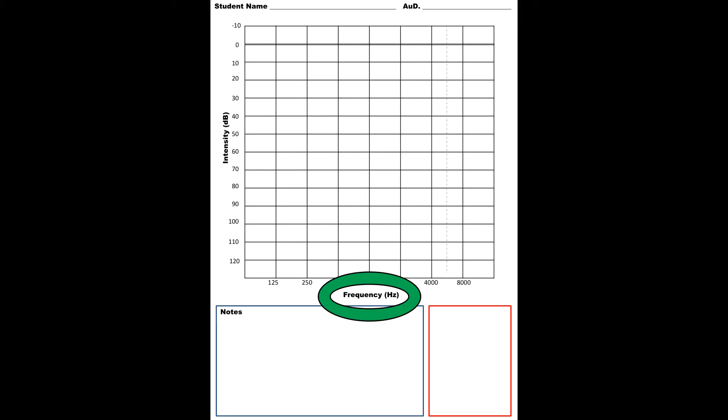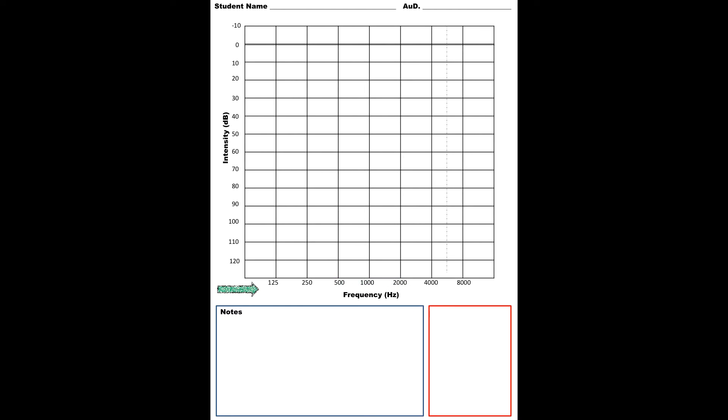There are a few things that you'll need to understand about an audiogram, and one of them is the frequency. You find this along the x-axis, and frequency is represented in Hertz. Basically that just means how many cycles per second the sound wave is completing.